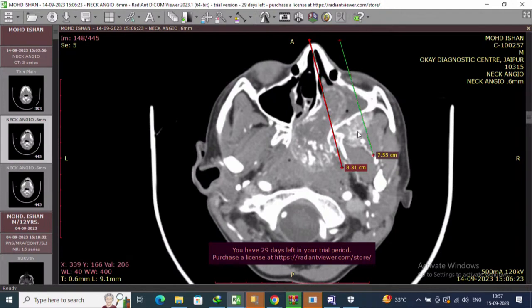Now, this tumor is principally supplied by the internal maxillary. And where is the internal maxillary located? Behind the posterior wall of the maxilla, it comes in the pterygopalatine fossa. So I will show you this CT angiogram, how the internal maxillary, the vascularity, this tumor is defined. You have to see yourself, assess yourself, rather than relying on radiologists. They can't furnish that much of the detailed information.